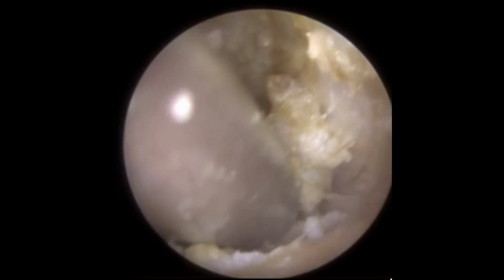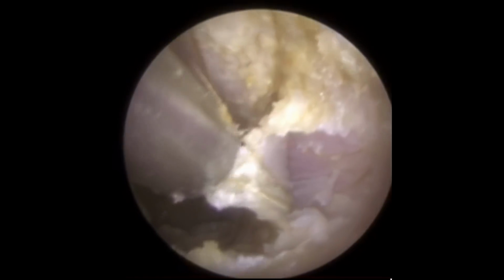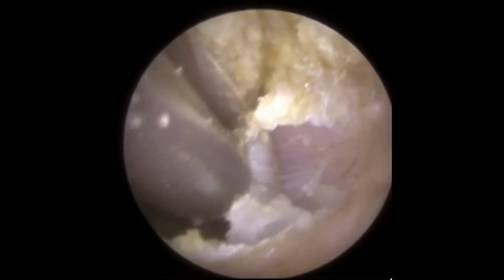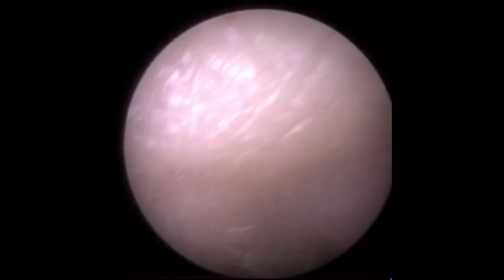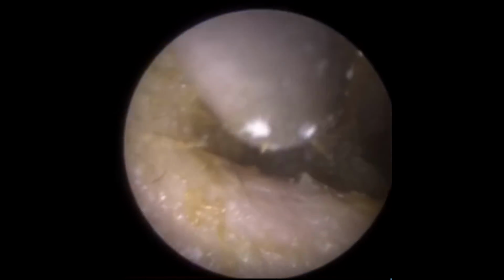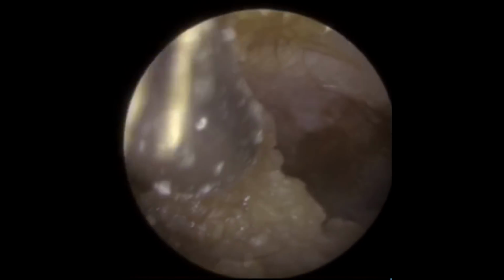So with this patient, you can see there's a lot of dead skin that's coating his ear canal, and it's actually occluded his eardrum as well. So this dead skin extends all the way from the entrance of his ear canal all the way onto his eardrum, and there's a thick layer of this over his eardrum. Obviously at the end of the video we did remove all of this.